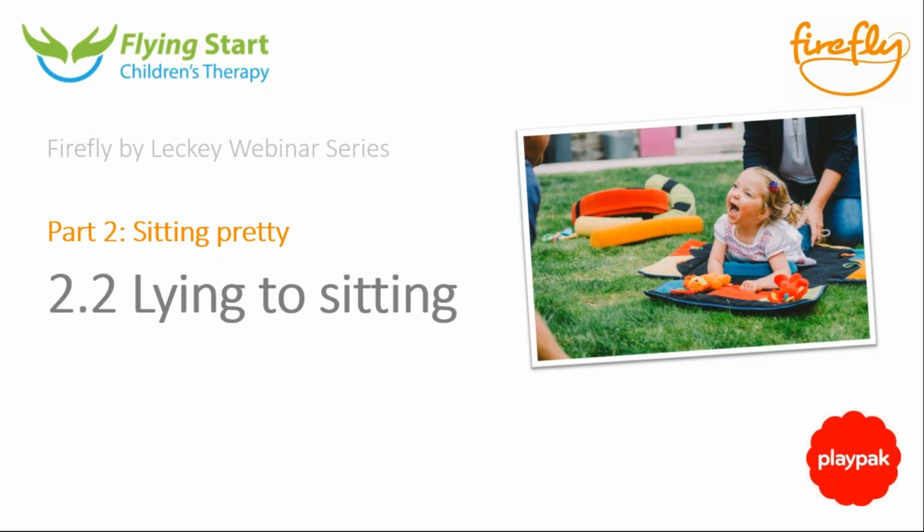You almost give him, so you say he can sit by himself, and that's excellent, and you would definitely work on that, but work on individual bits so that yes, you do the independent sitting at times, but then you also work with a lot more support than he actually needs, so that, for example, maybe you have 2 of the red horseshoes and 1 of the smaller ones right at the top, so that he's got his trunk fully supported by the red horseshoes, and then the green horseshoe at the top that pushes his shoulders forwards in that protracted position.